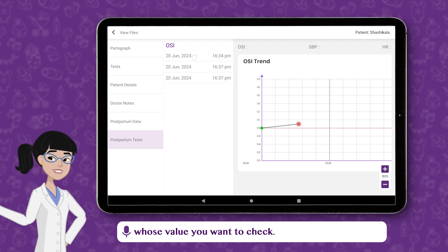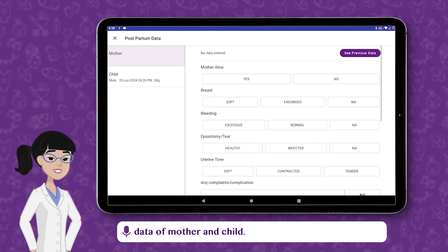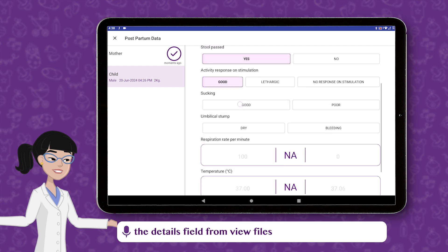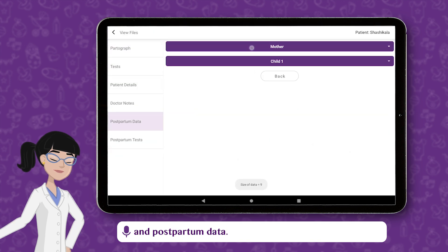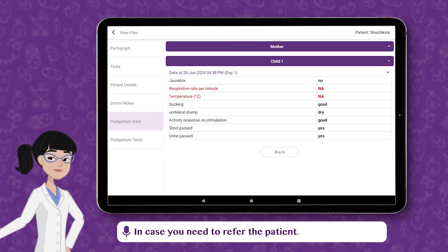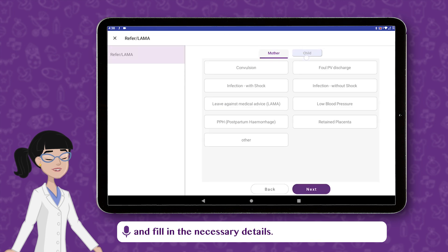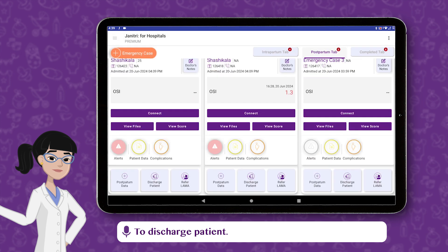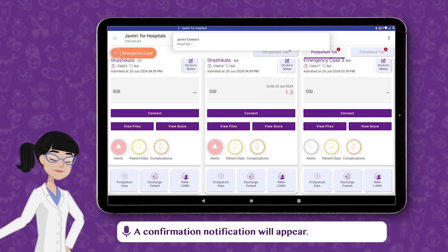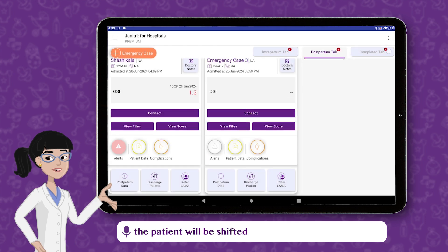Go to View Files and Postpartum Test to check OSI Trends. Select the test whose value you want to check. Fill the postpartum data of mother and child. You can check the details filled from View Files and Postpartum Data. In case you need to refer the patient, go to Refer/Lama and fill in the necessary details. Go to Discharge Patient to discharge the patient. A confirmation notification will appear — tap Yes to discharge the patient.